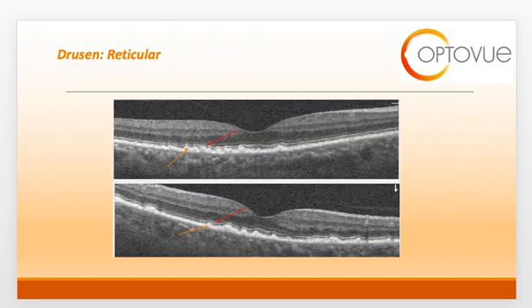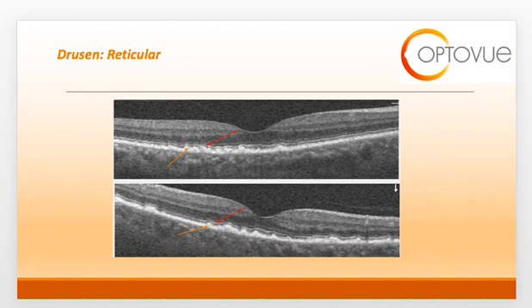This next slide demonstrates reticular drusen, another type of drusen that differs from the previous types because it resides in a subretinal space and are thus called reticular pseudodrusen. They can be confused with drusen, but they're actually a clinically distinct entity located above the RPE. The deposition presents as a hyperreflective material between the RPE and the ISOS junction. Reticular pseudodrusen are associated with progression to advanced AMD, so it's important to be able to recognize them on your OCT scan.